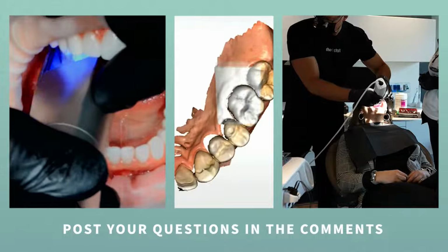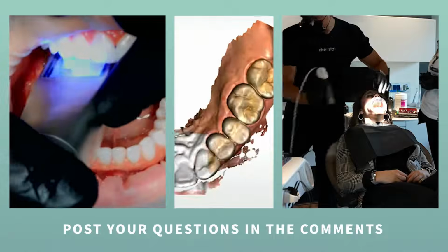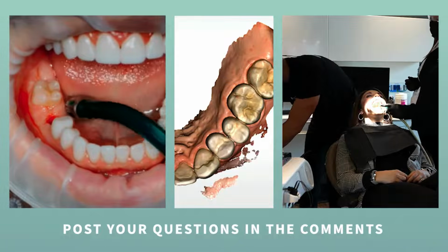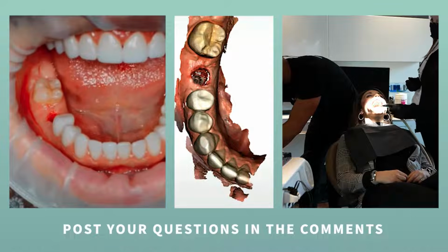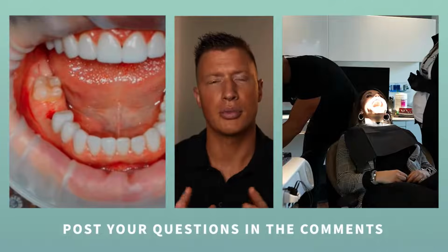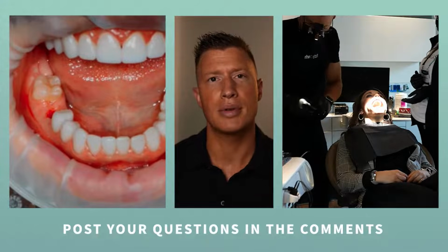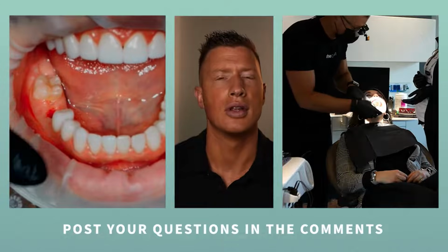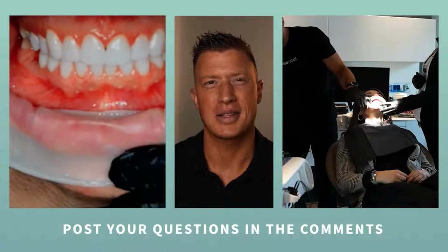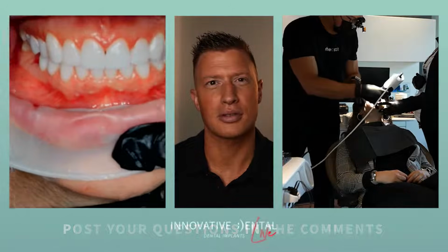So, implants is about placing the implant in the proper bone and getting it in the right space in bone for the future crown, but it also has a lot to do with how we're going to use the gums to be healthy and put the right amount of pressure and shape, so that way everything looks natural at the end, right? We want our implants to be not something that looks like an implant. We want it to look like a natural tooth.